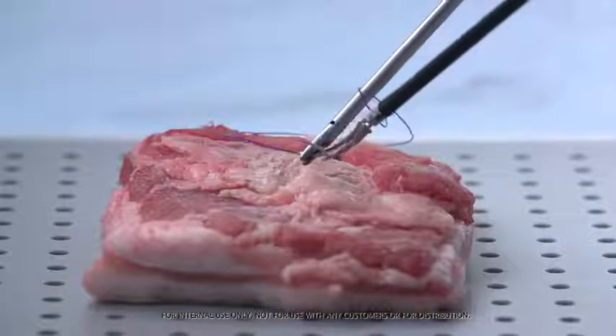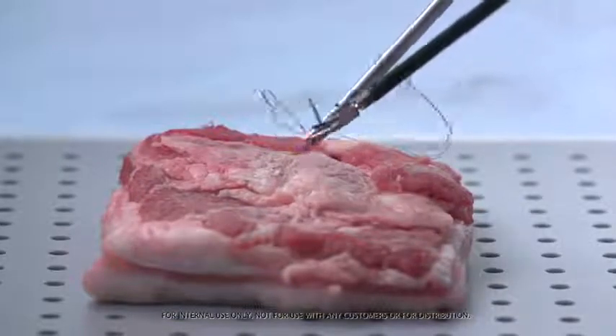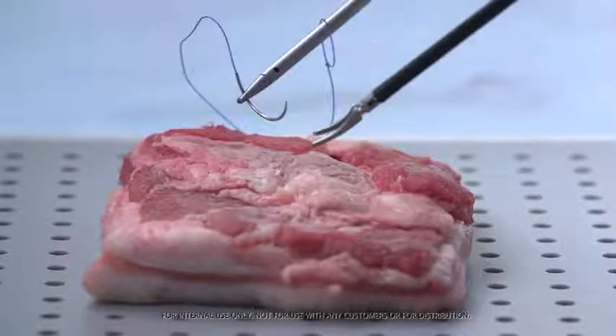Before taking the first bite, make sure the fixation loop is around the shaft of the needle holder. Inserting the needle driver through the loop allows you to more easily initiate closure intracorporeally and helps prevent the adjustable fixation loop from closing as it is inserted down the trocar.